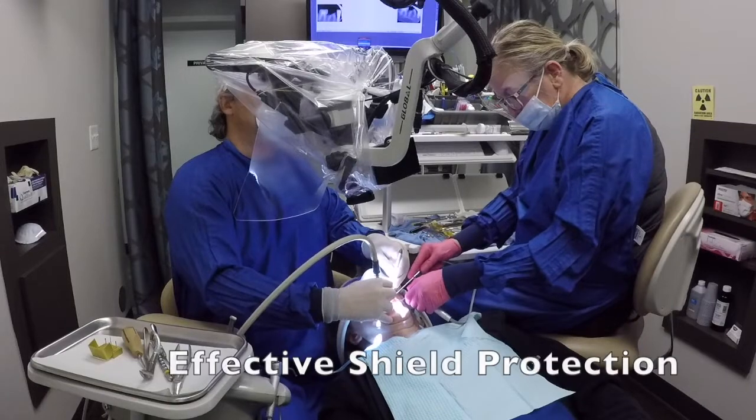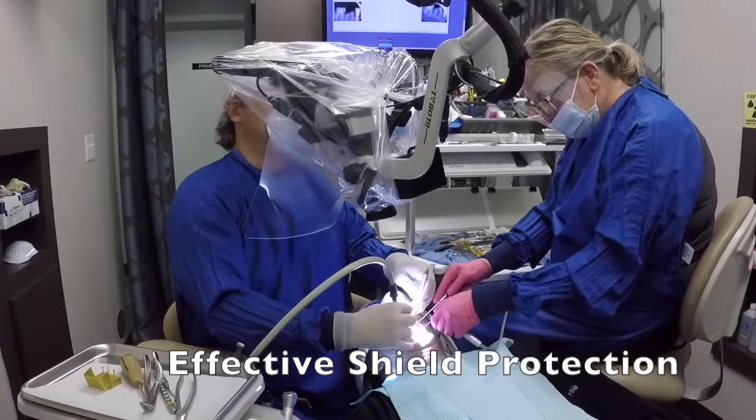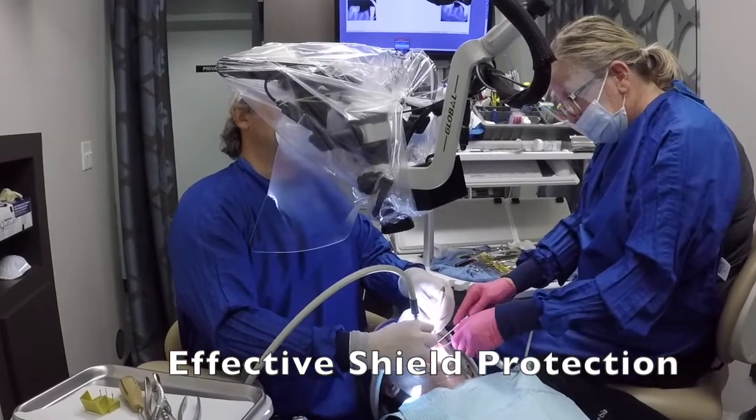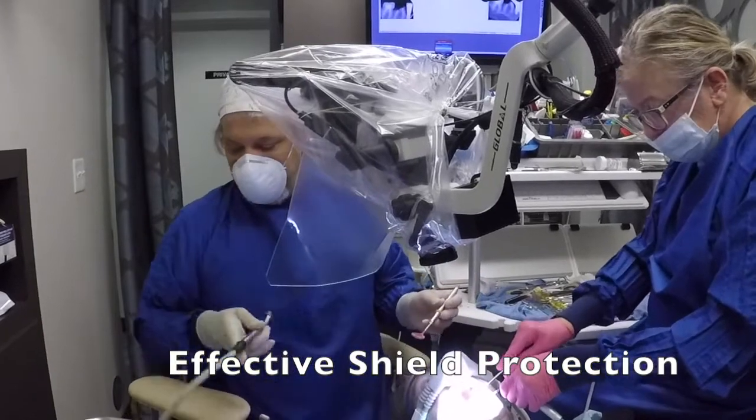Hi everyone, it's Bill Winger from A-Med. I want to share with you this video of how to make a face shield for the dental microscope. Since a traditional face shield cannot be worn while operating the microscope, a piece of plastic has been adapted to fit on the microscope to serve as a face shield.